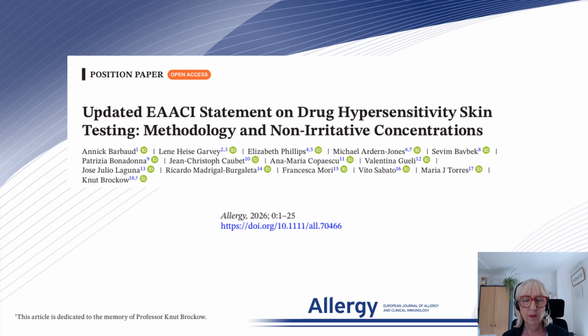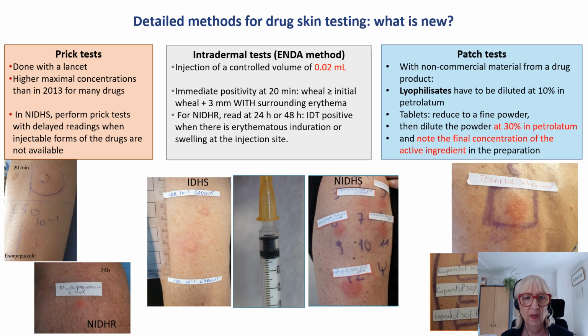Dear colleagues, the new recommendation for performing drug skin tests and the non-irritative concentrations of drugs for skin tests are now published in Allergy. You will find the detailed method for drug skin testing, prick test. For intradermal test, we recommend the ENDA method in injecting a control volume of 0.02 milliliters and detail the method for reading intradermal tests for immediate and delayed hypersensitivities.